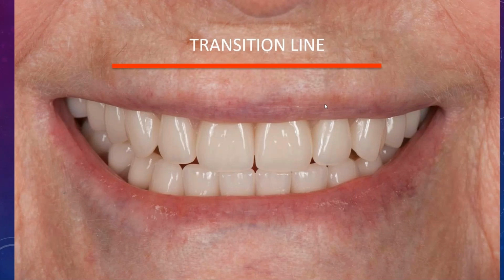For patients with a very high transition line, one of 2 things could be done. One, we can just change the type of restoration to an overdenture. It could be a bar overdenture, it could be locators, depending on what you want to do. Or you can do more bone reduction while you're planning to move that transition line up higher in order to give your patient a screw retained hybrid, per se.